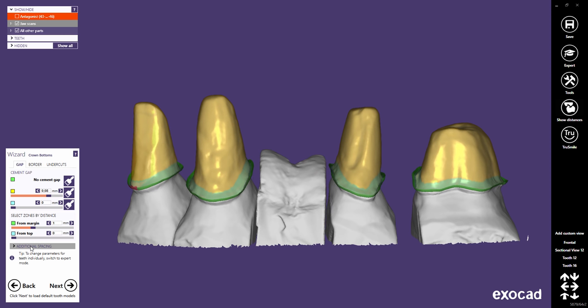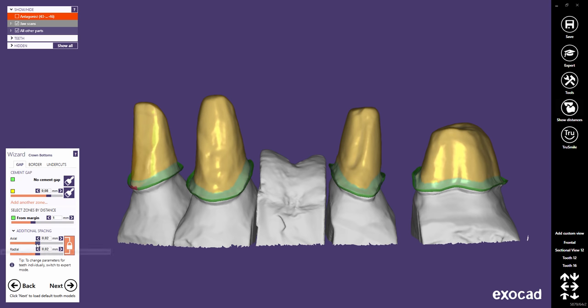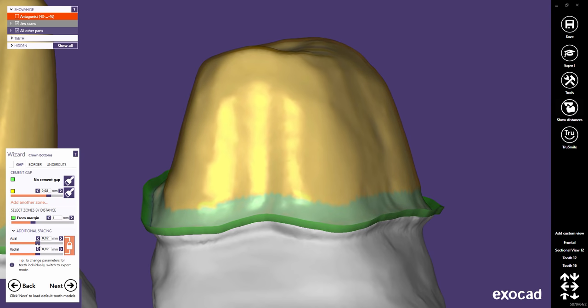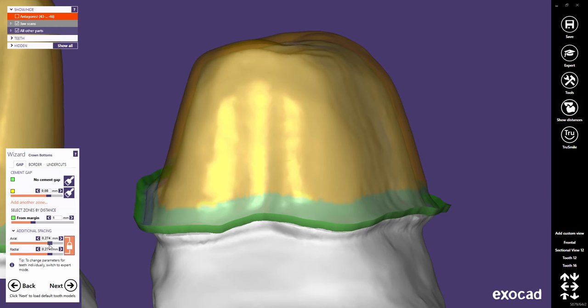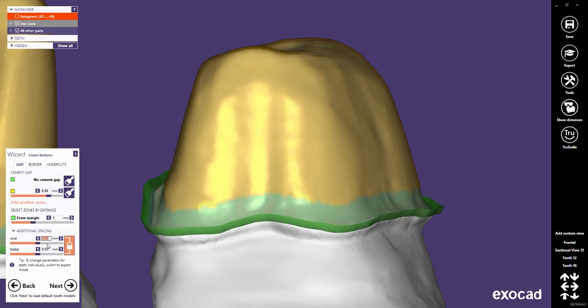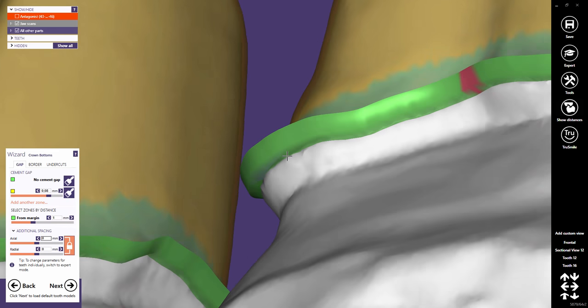Additional spacing allows you to add additional offset spacing to the entire crown bottom, independent of the cement gap. This means that the cement gap will be applied on top of the additional spacing. The axial spacing will add offset in the occlusal direction; the radial spacing will add offset perpendicular to the occlusal direction. Both sliders are locked so that offsets are added equally spaced to the three axes. The higher the values, the looser the fitting.